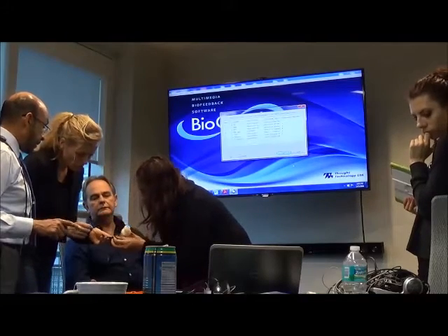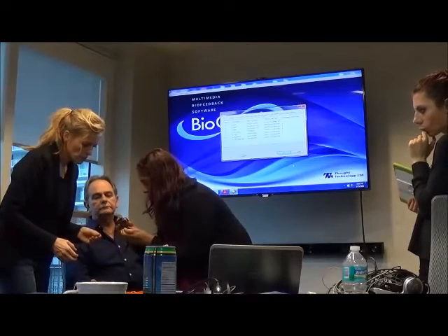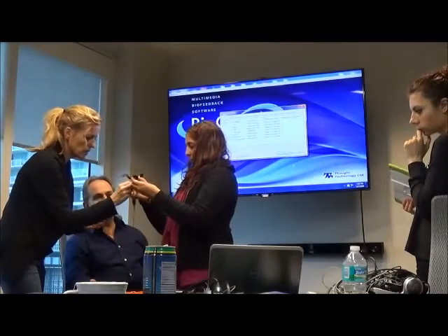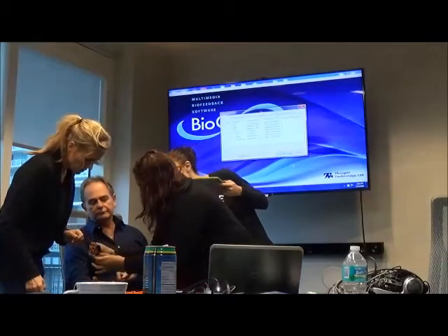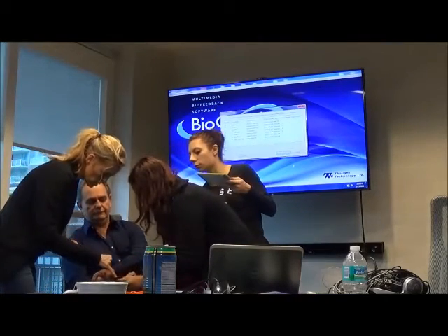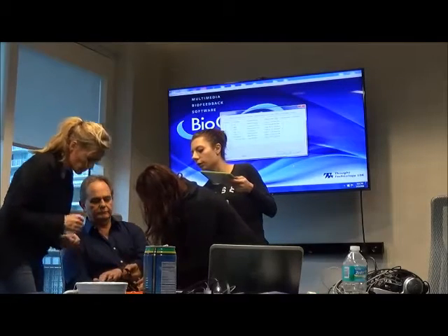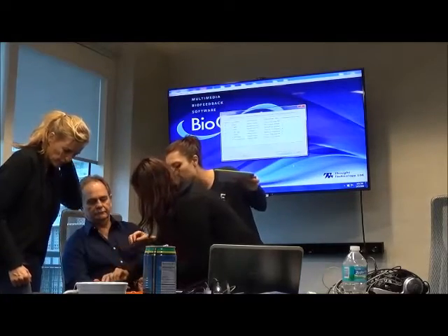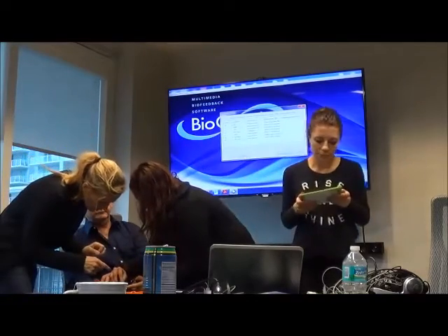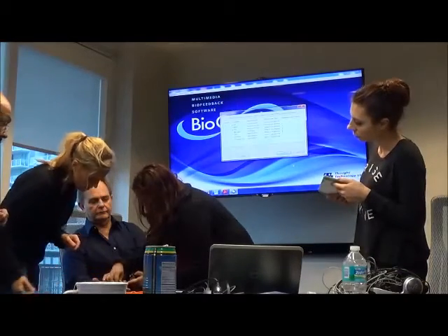That's too much. No, that's okay. There's a certain number of uses in each sensor. 100 uses. Right, because even though they have that number, if somebody's using abrasives to clean them, maybe it lasts a quarter of the time it should. Yes, that's correct.